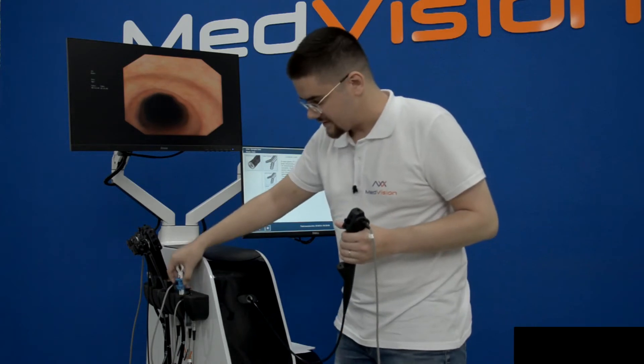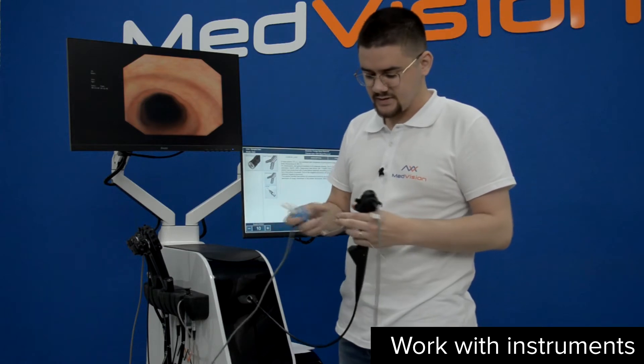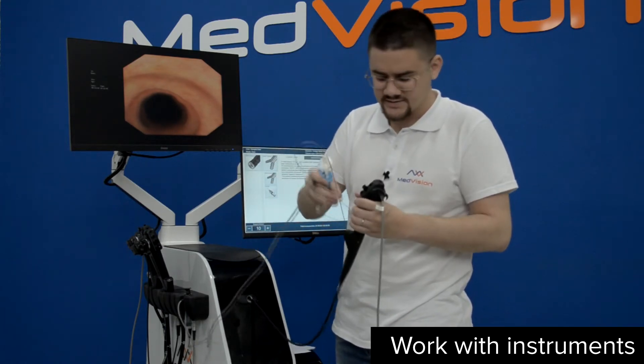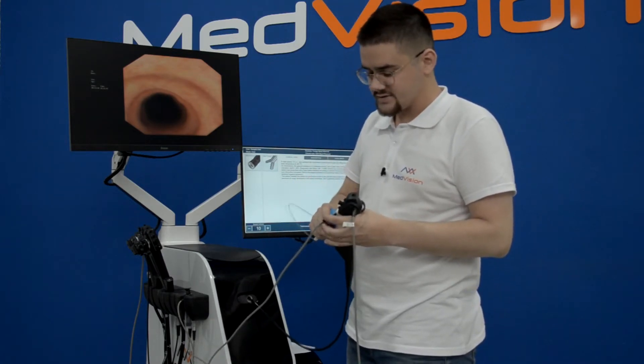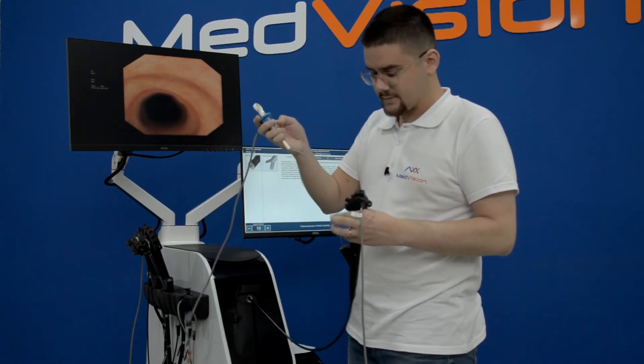The universal instrument imitator has a flexible metal part, and you introduce it at the base of the instrument — in this case the bronchoscope. You introduce it until you see it on screen, which might take almost the full length of that part.